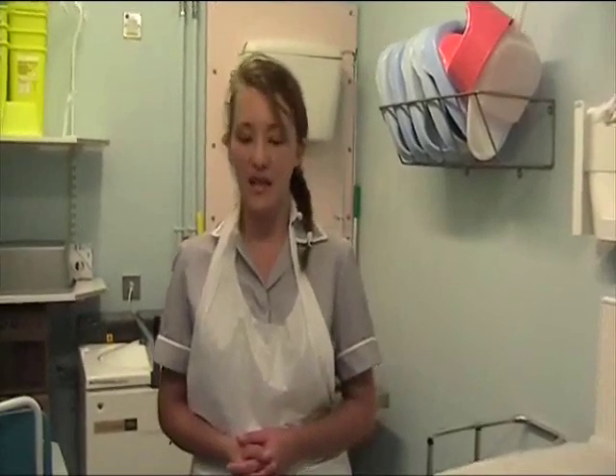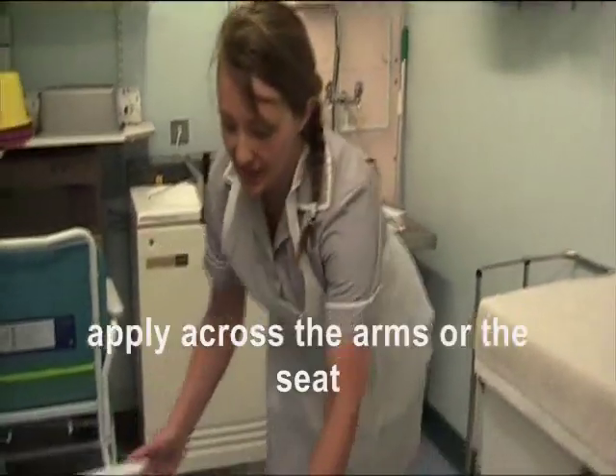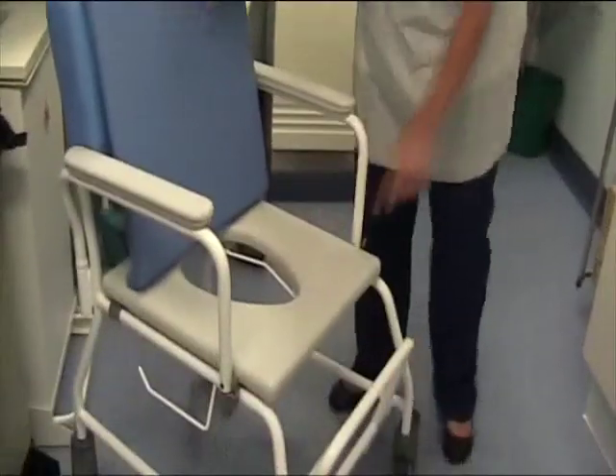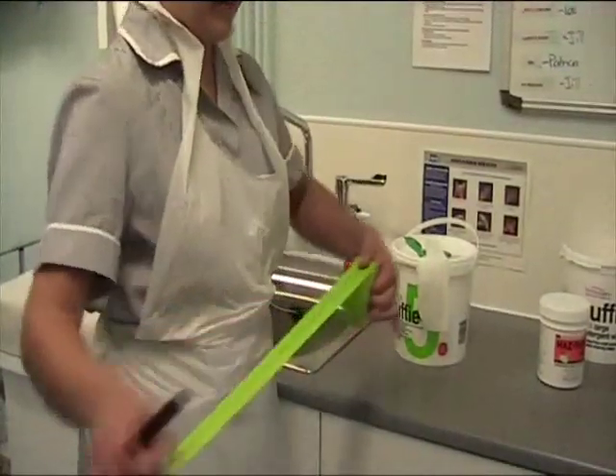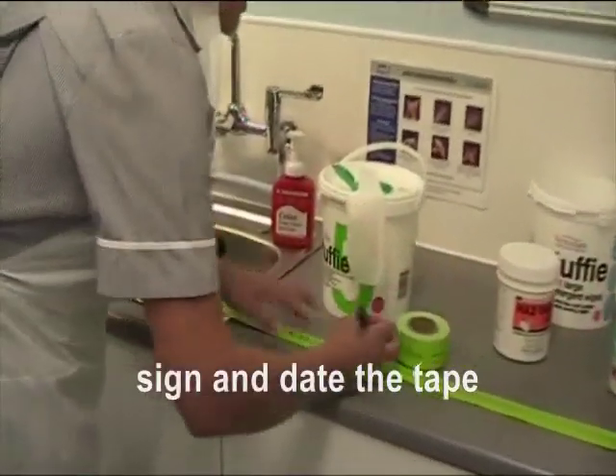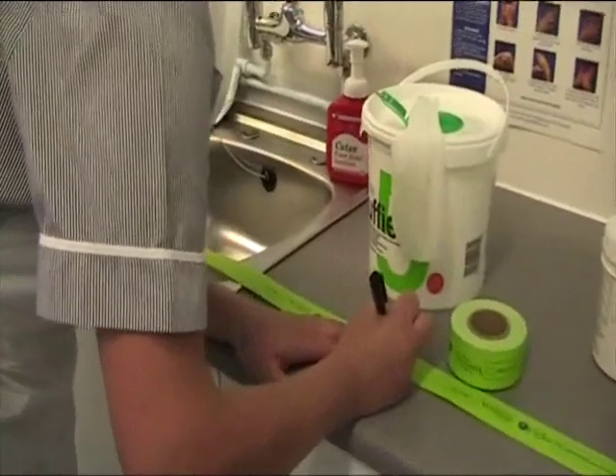The final thing is to apply the Eye Arm Clean Indicator Tape. You should apply this either across the arms or across the seat. Sign and date it to show that it is clean.